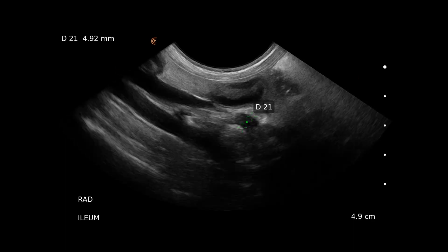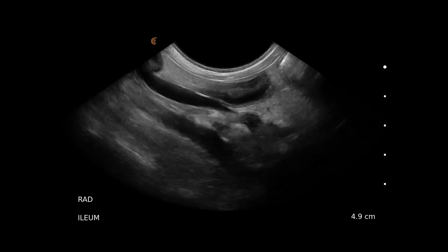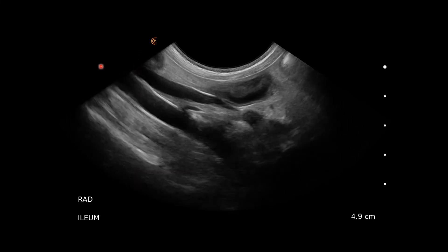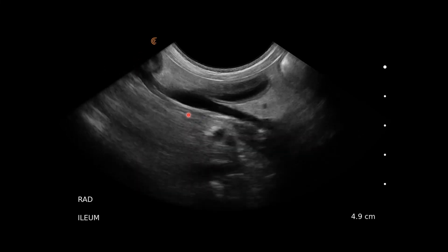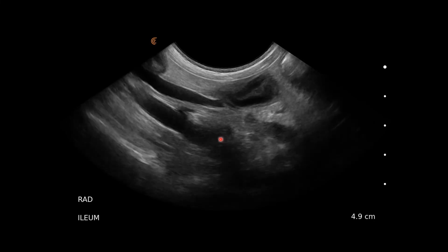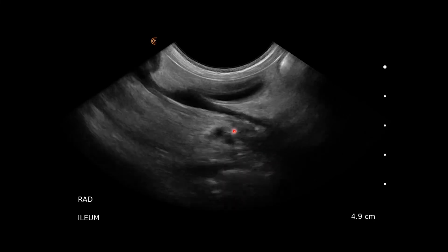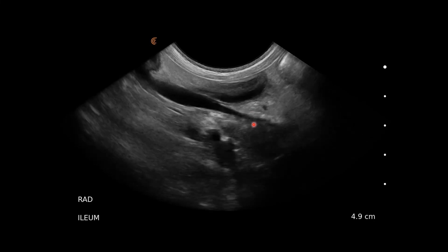Here we can see the caudal vena cava and the aorta, and where they are separating moving cranially in the abdomen, we can see the right adrenal measuring at 4.92 millimetres. We've got the caudal vena cava coming down here and the aorta here. We can see the left renal artery and the cranial mesenteric and coeliac arteries, and we can even spot the left adrenal and the right adrenal on this side.